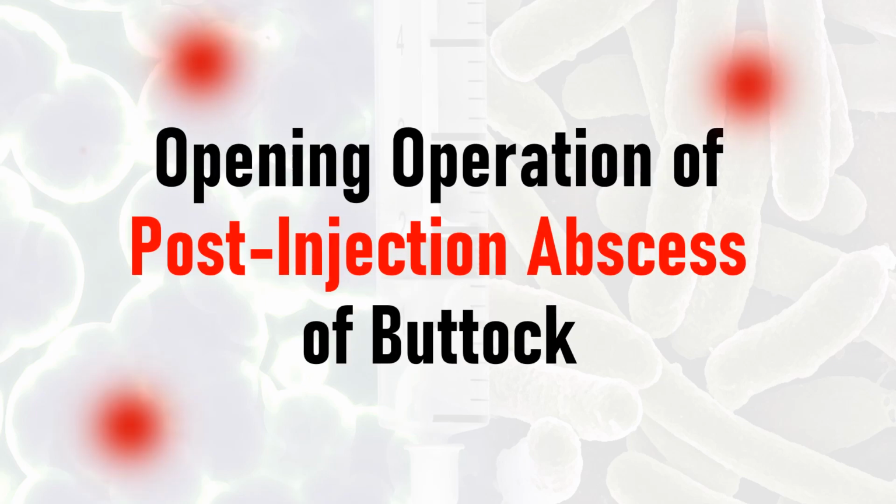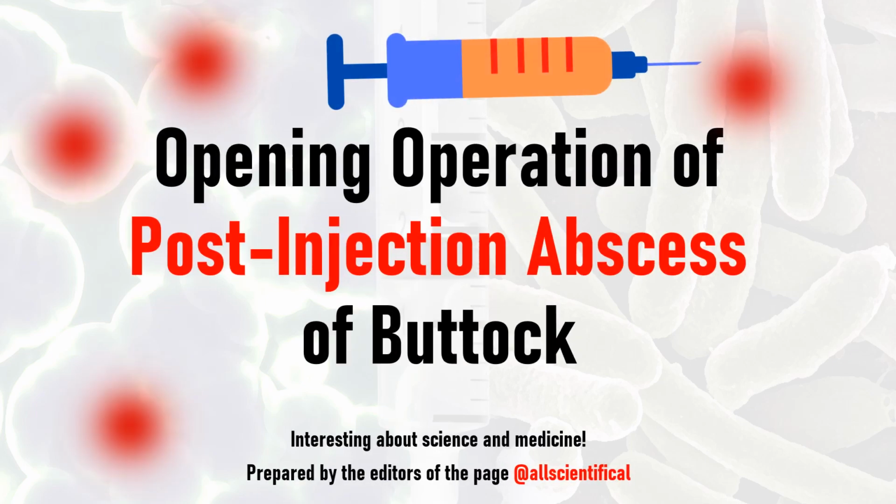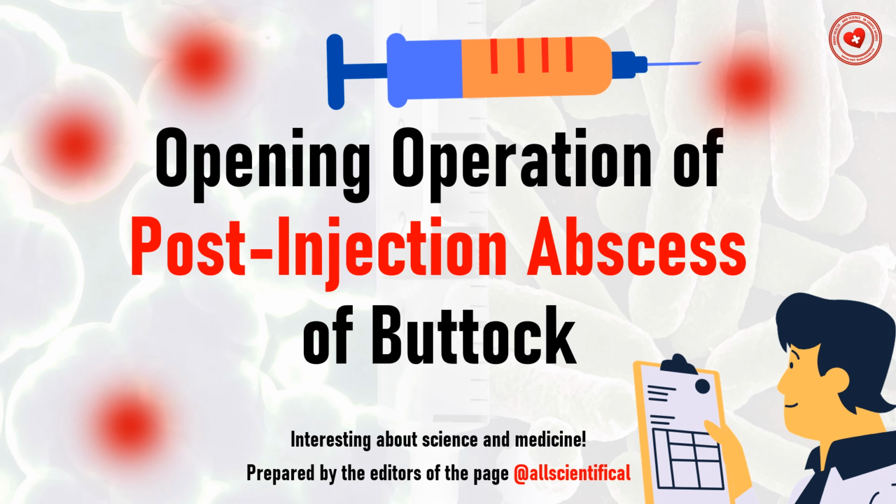Opening operation of post-injection abscess of buttock. Interesting about science and medicine, prepared by editors of the page All Scientific.